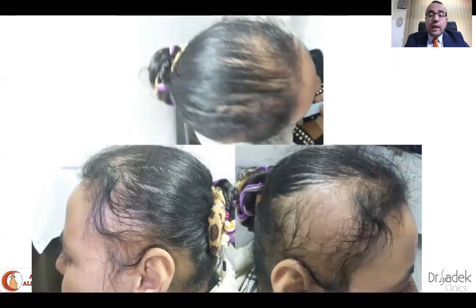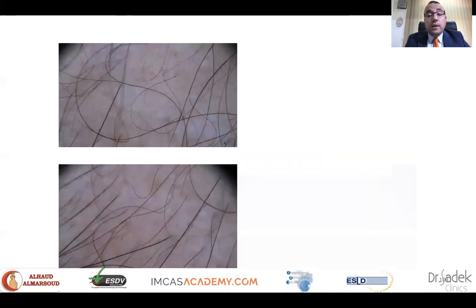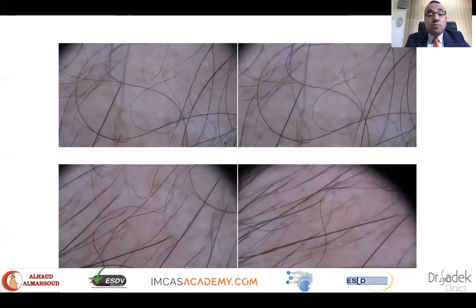In the eighth scenario, we can also use trichoscopy at the aesthetic clinic. Yes, like this lady who's suffering from hair loss. She's not aware of what's going on, but we can see the fringe sign apparent at the frontal, parietal, and occipital regions of her scalp as well. And this is the trichoscopic assessment and images of her scalp, and a larger image.